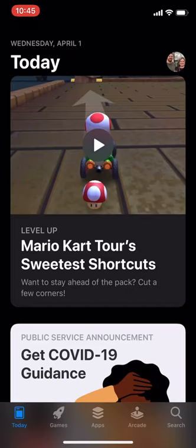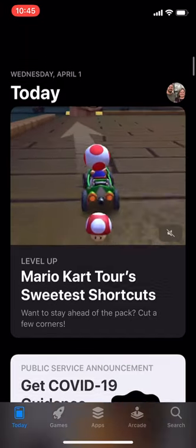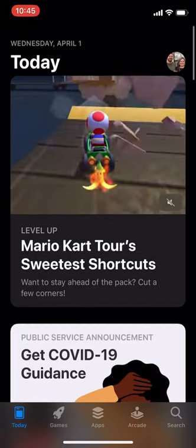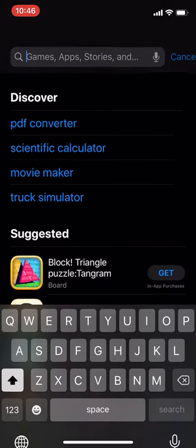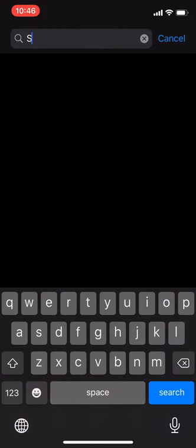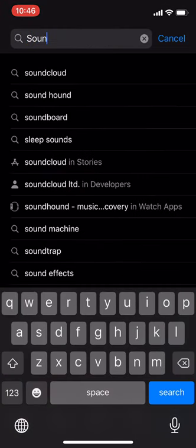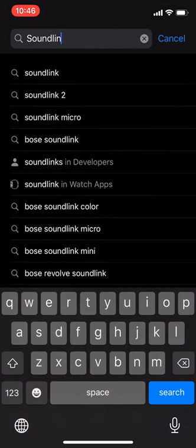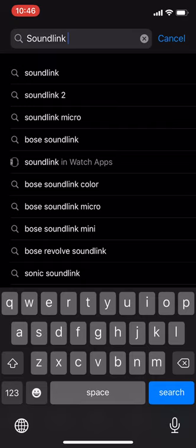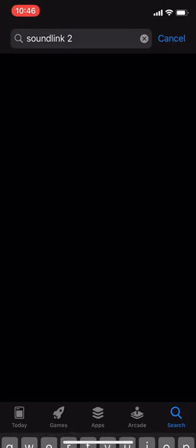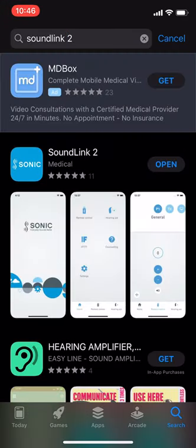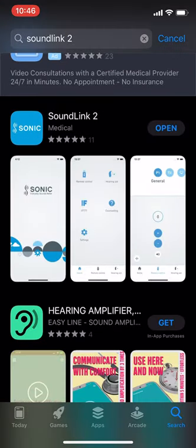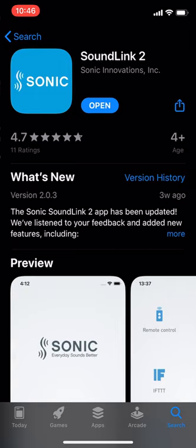Tap that and you're going to go to search, and you're going to type in SoundLink 2. So I already have it downloaded on my phone, but this is what it looks like right here. So you're going to download that app.